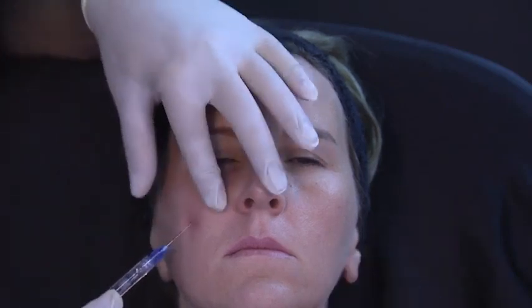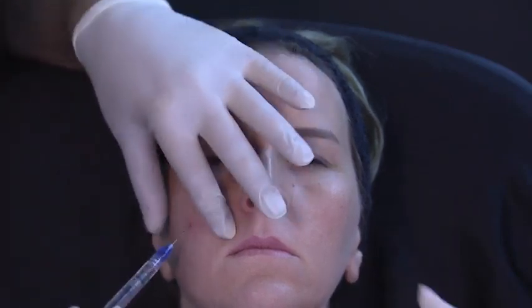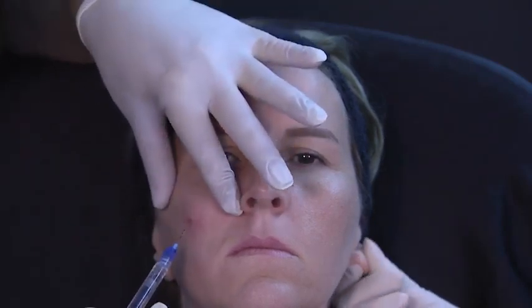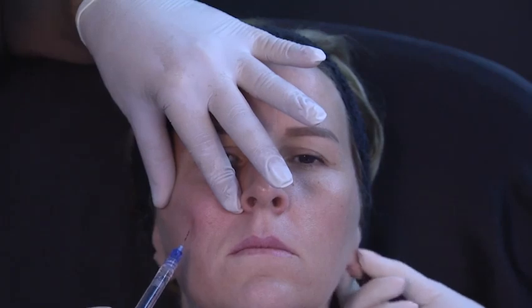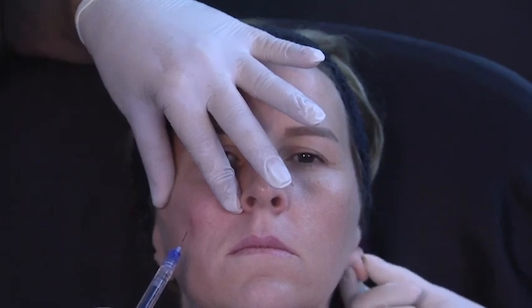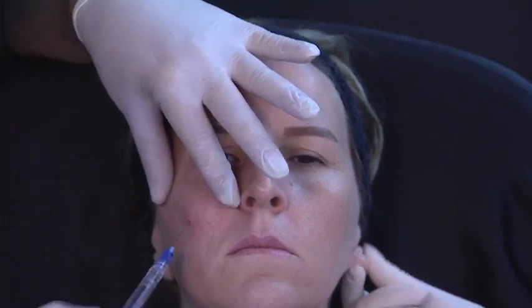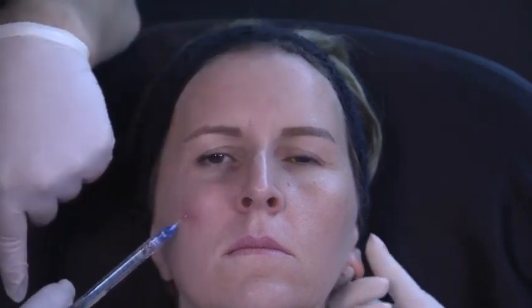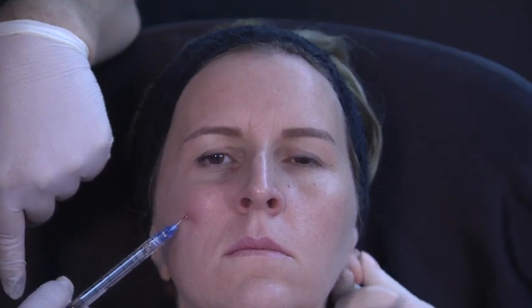Okay, so I am going to inject 1 ml, and I'm going now towards the zygoma to create a continuous convexity, what we call the Ogee curve, very slowly infiltrating with my cannula. Very slowly. Now I'm doing the fan technique. Remember, if I do it like this with my cannula, you cannot see my cannula.